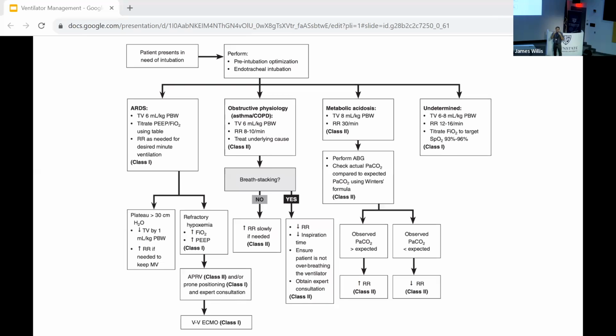If they're intubated for angioedema, the airway is taken, and the patient is really calm about it. You're like, oh my God, you're handling this very well. Your Ludwig's angina, you're handling very well. How are you so calm? I'd be freaking out. You can put them right on CPAP pressure support.